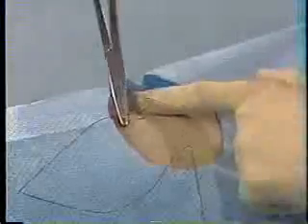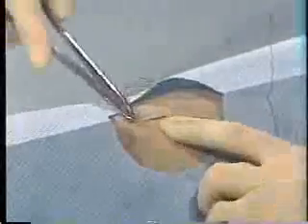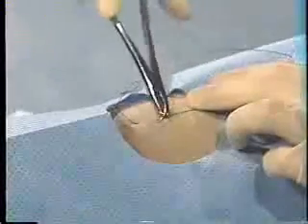If necessary, use the pickups for better traction on the skin. Guide the needle parallel to the skin, just under the surface, that is, in the subcuticular area. Notice this is not as deep as the subcutaneous layer where there is fat. After the first stitch, start the next one directly across on the other side of the wound. Continue in this manner to the end of the wound.